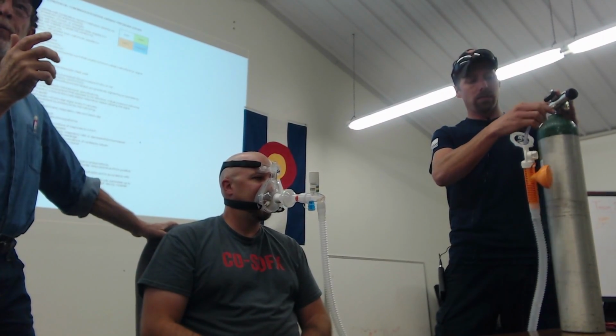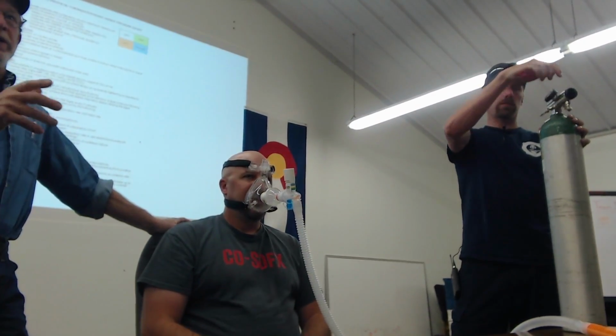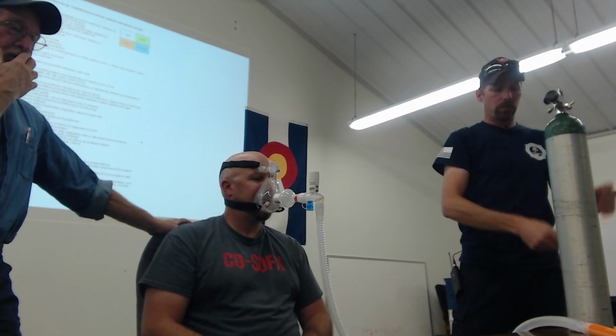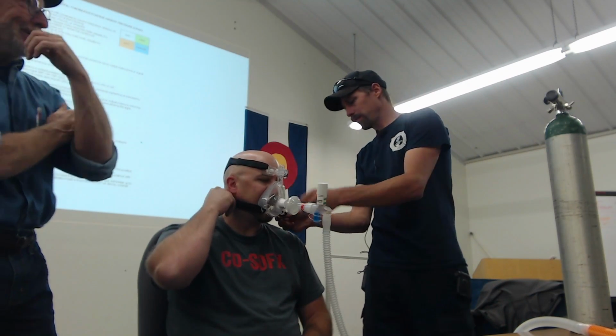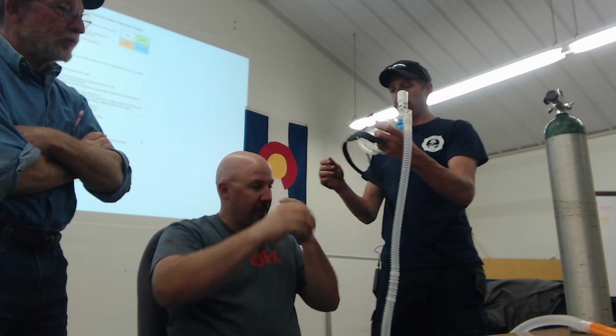So this is CPAP by itself, and again, to titrate the pressures up, you use this knob to titrate the FiO2s up. I would slowly increase the pressures before you increase the FiO2s for the reasons Tyler mentioned. I think I would get up to 7.5 and 30, and then depending on patient status and difficulty with tolerating this too, because it's not the FiO2 that makes this difficult to tolerate, it's the pressure. And maybe afterward, if you guys want to come and see what it's like, you'll see for yourself.